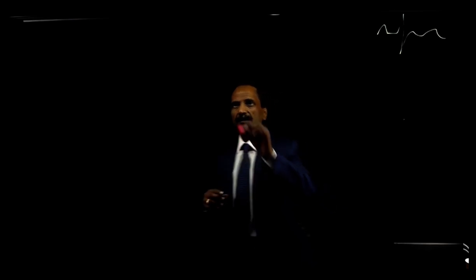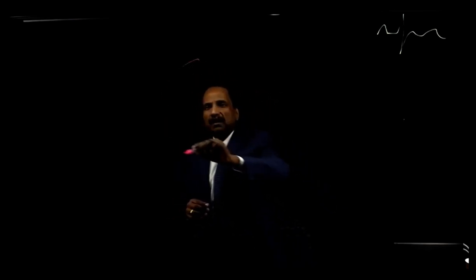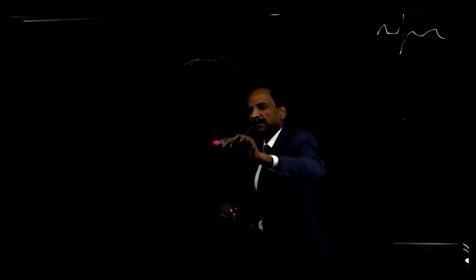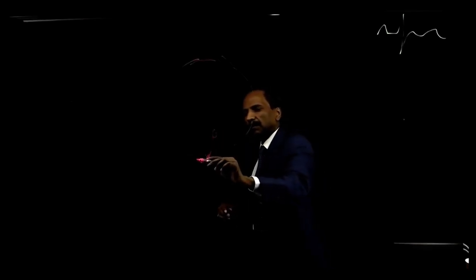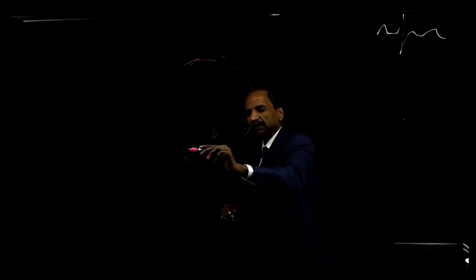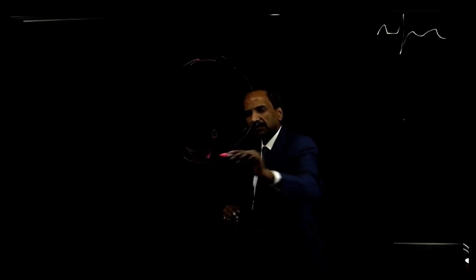But here's the issue. When we have the peritricuspid valve, IVC, and we're ablating flutter here. Now, the epicardial fibers, endocardial fibers in the vestibule of the right atrium.